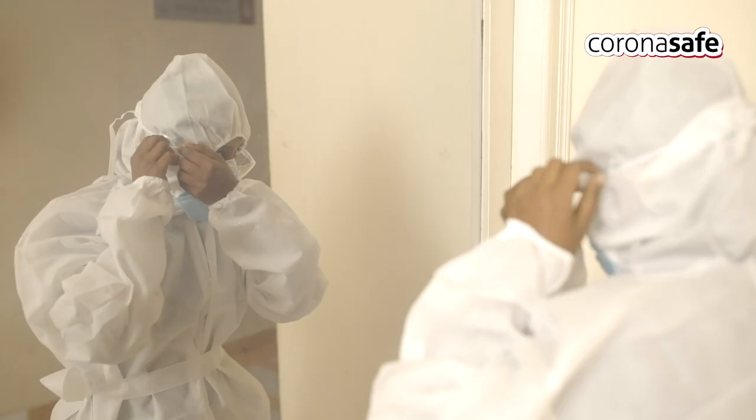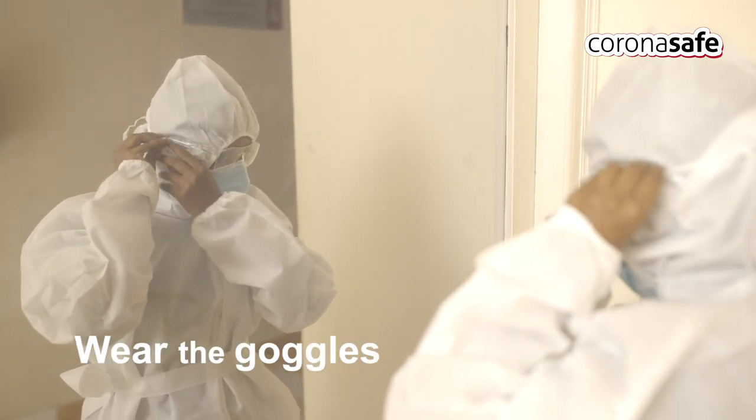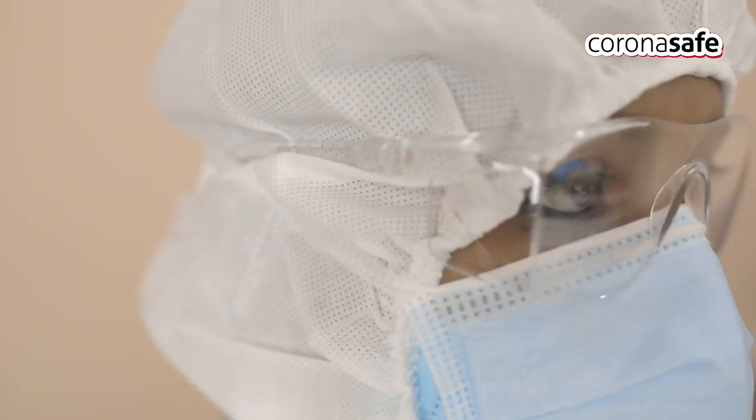Wear the goggles. If the goggles are the spectacle type, secure the legs of the goggles under the lace of the triple layer mask. Use personal spectacles inside the goggles if needed.